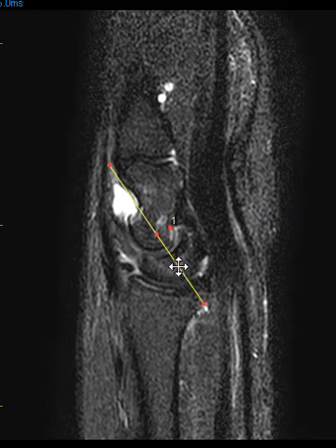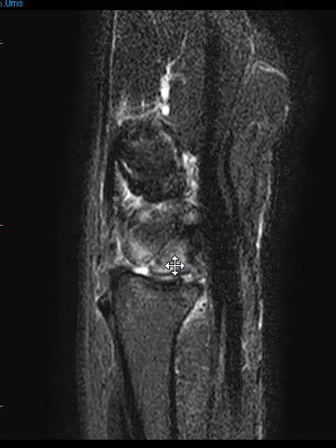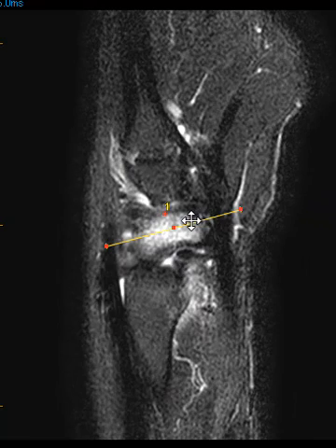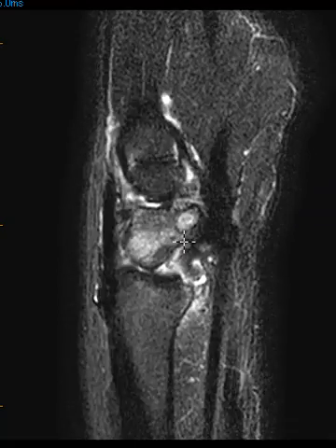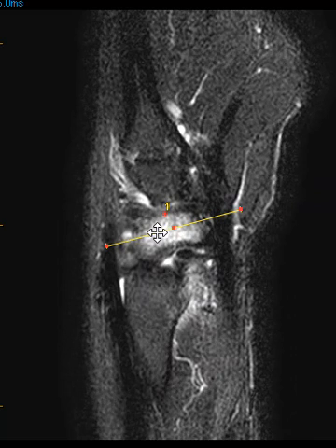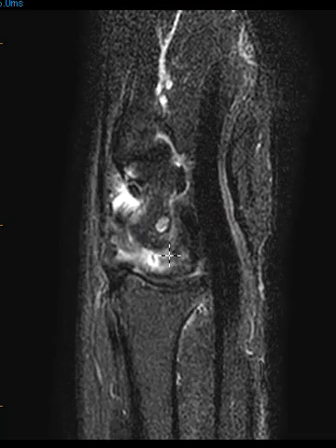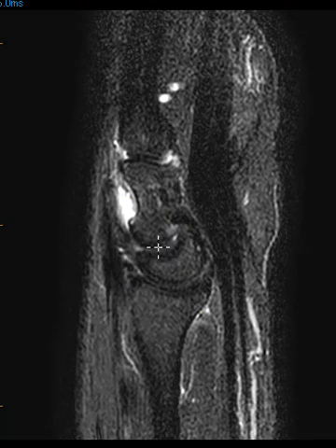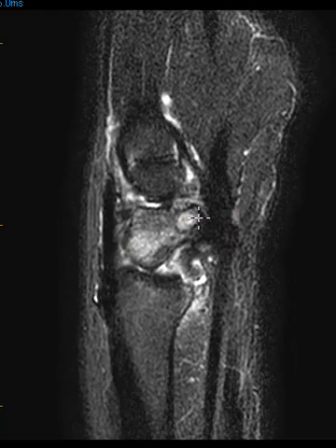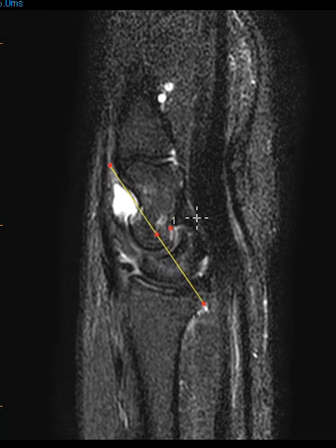The scapholunate angle, which is the angle between the lunate bone and the scaphoid bone, should be less than 60 degrees. This is greater than or at least 90 degrees here — so this is abnormal. When this happens, the scaphoid bone, instead of being more obliquely oriented like 45 degrees, becomes horizontal. The lunate bone will tilt backwards, increasing this angle, and the scaphoid increases in the other direction. If that angle is greater than 60 degrees, that's abnormal.